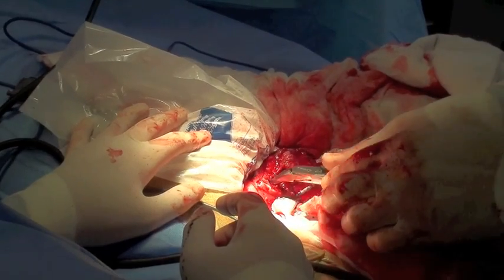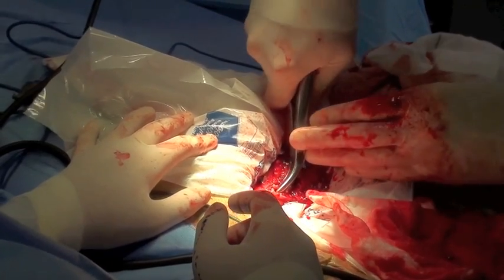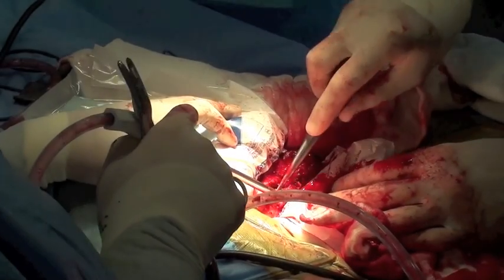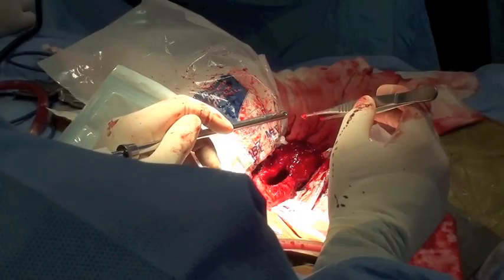A bone curette is used to remove tumor material from the medullary canal of the bone and to enlarge the window. A bone curette is also used to remove the bulk of the tumor from the medullary canal.